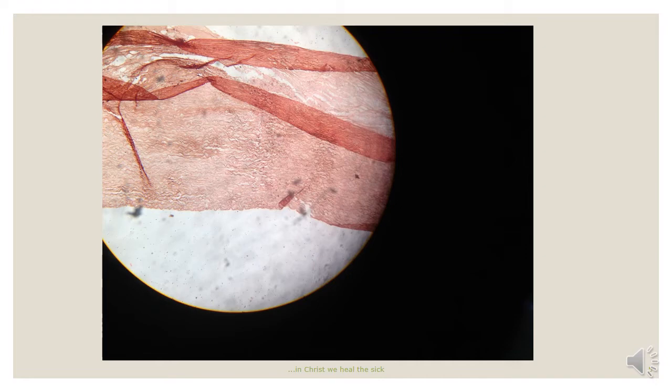So what are the examples of the elastic arteries? Mainly these are the large vessels, which include the aorta, the brachiocephalic trunk, the common carotid artery, the subclavian artery, and most of the large pulmonary arterial vessels.